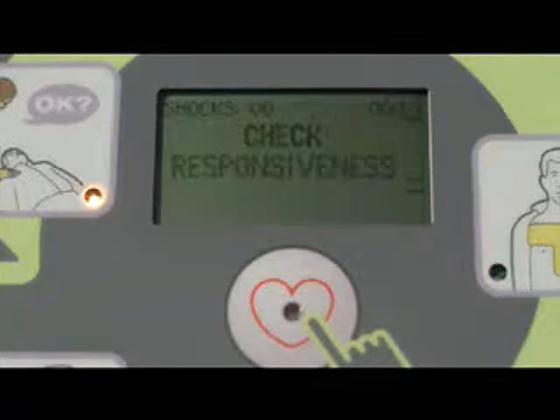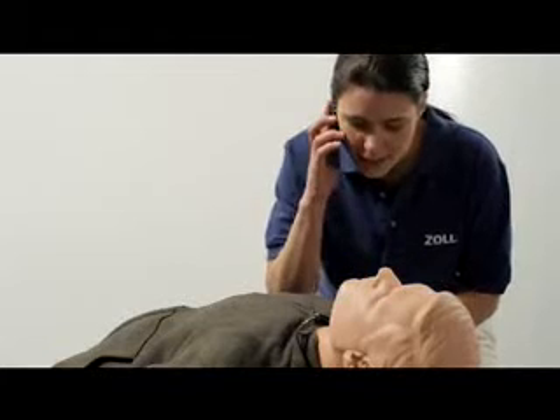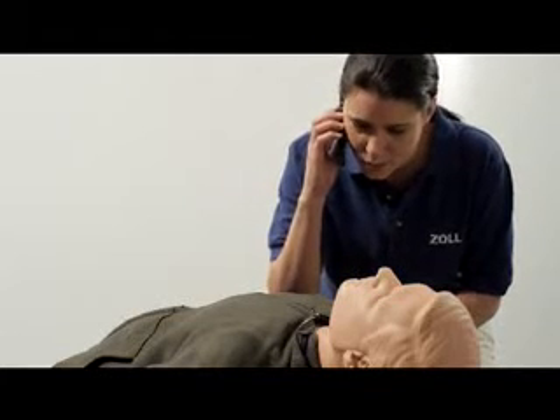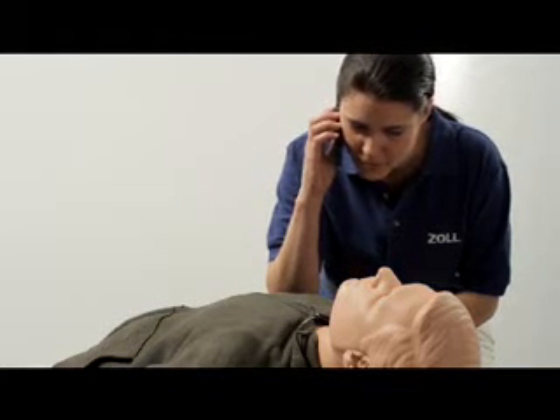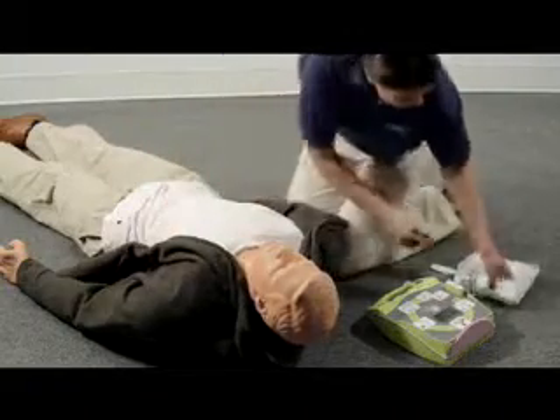Check responsiveness: "Are you okay? Call for help." The rescuer calls emergency services: "Hi, this is Julie Sanders. I'm at 445 North Park Avenue and my friend is unresponsive. Please send help." Then attach the defib pads to the patient's bare chest.